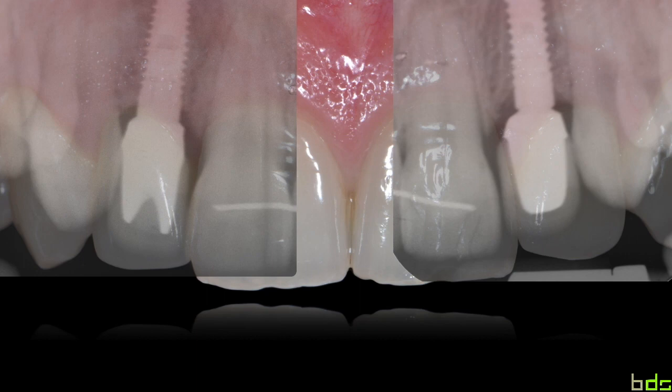However, it's important to note that both implants respond differently. You have some dieback of the bone on some implants and others that don't lose, let's say, bone in the first year in function. And we wanted to know what is the effect on the clinical level.